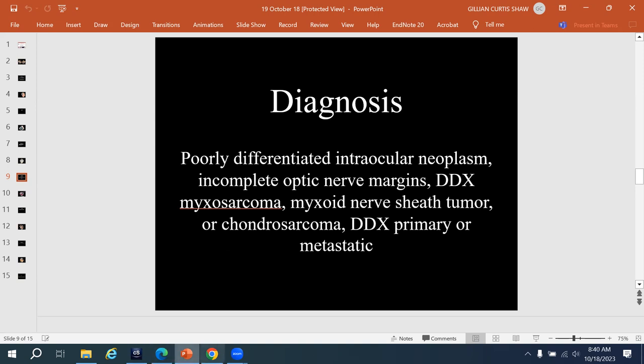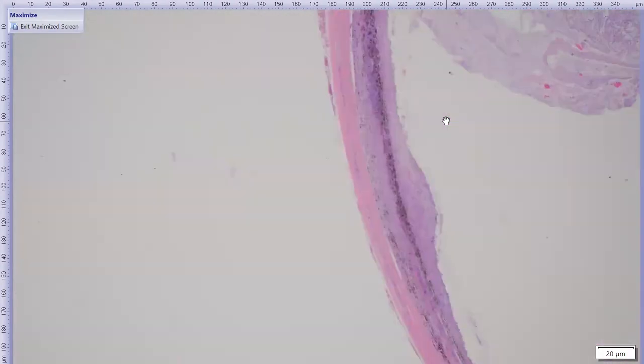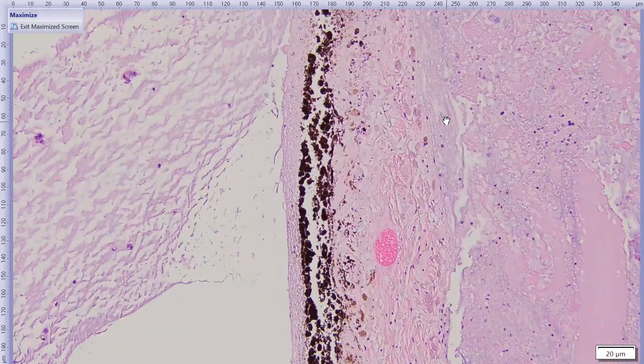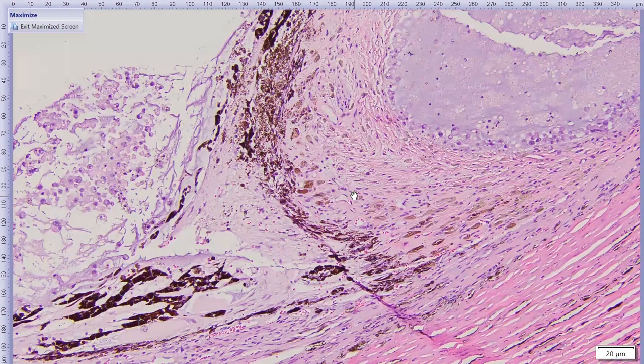Another feature, which I'm going to quickly show you before we move on from this case, that was interesting, although hard to necessarily draw conclusions from, in terms of the debate over metastasis versus a primary tumor: the iris leaflet on this side of the globe is totally infarcted. It's necrotic with a coagulative necrosis, so you can still make out the tissue architecture. It's just that the cell detail is totally gone. So just sort of skating along this infarcted iris and a segmental delineated coagulative necrosis. And it kind of makes me wonder if there's something going on in the vessels nearby. That said, I scoured these slides and didn't find any intravascular neoplastic cells.